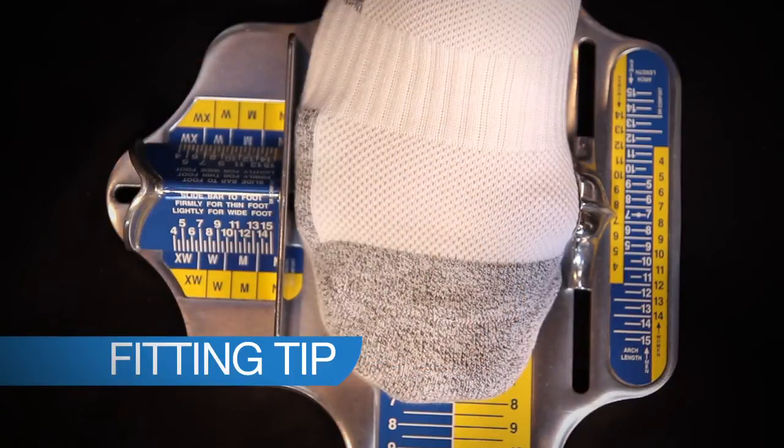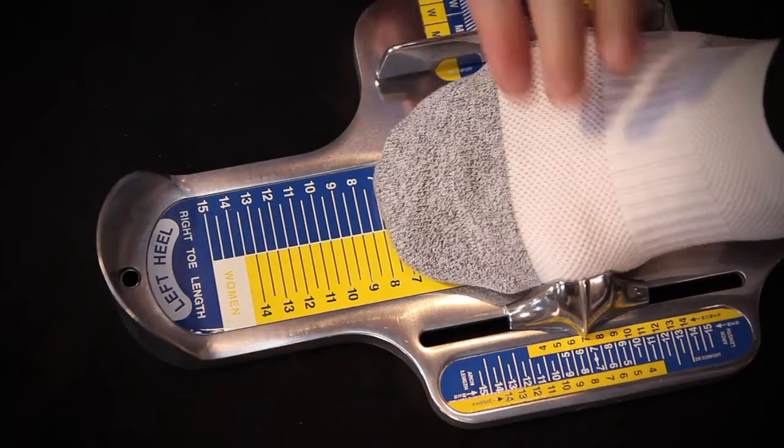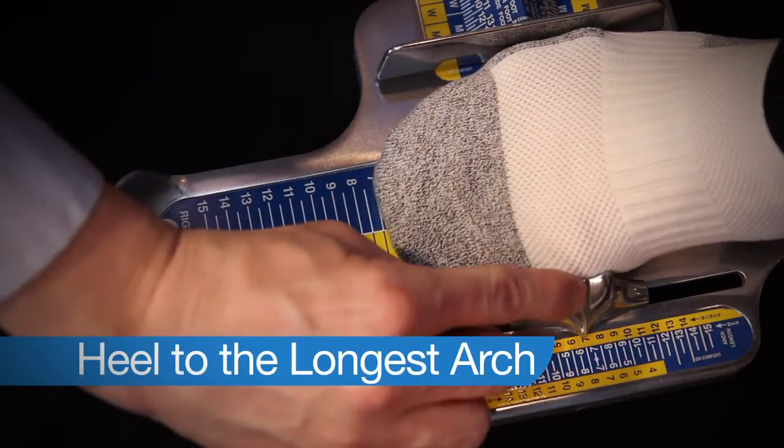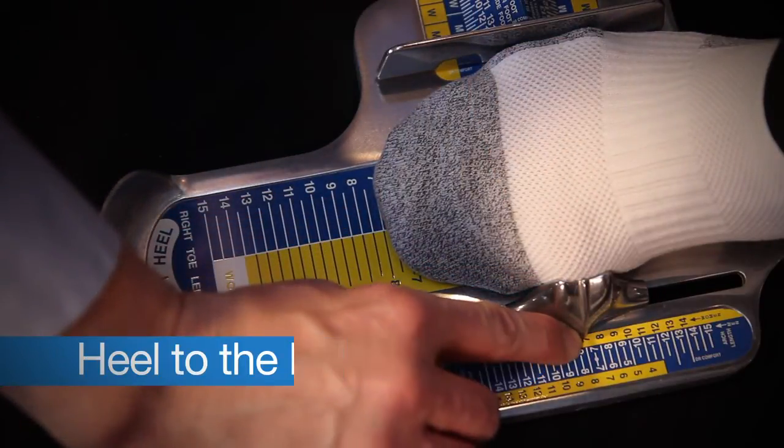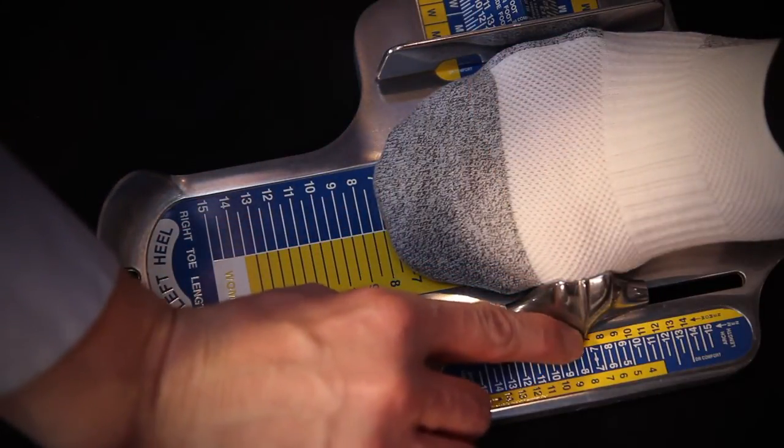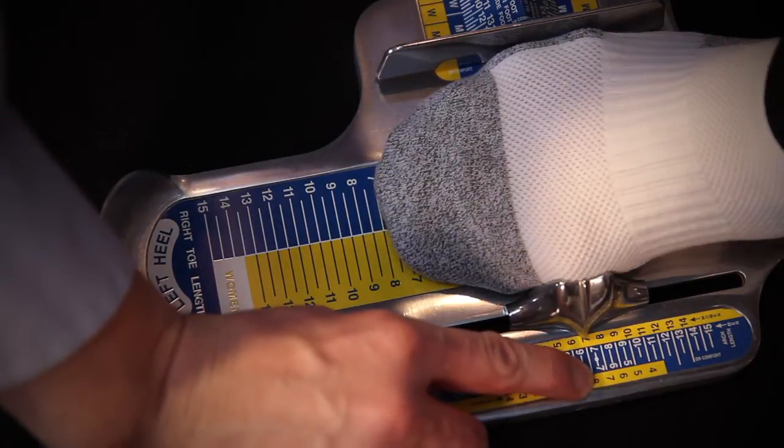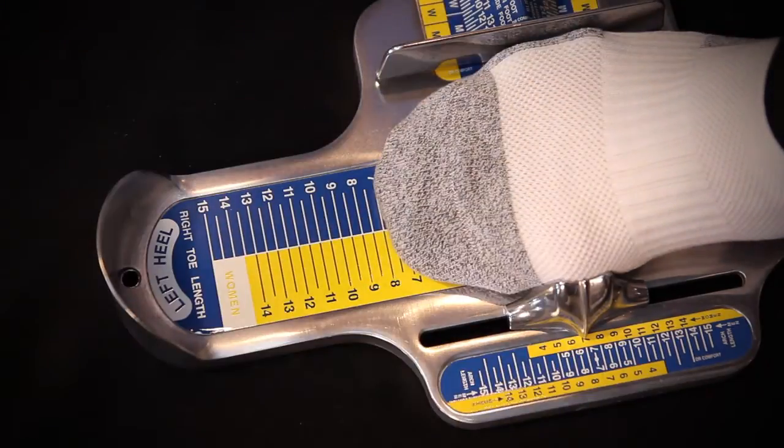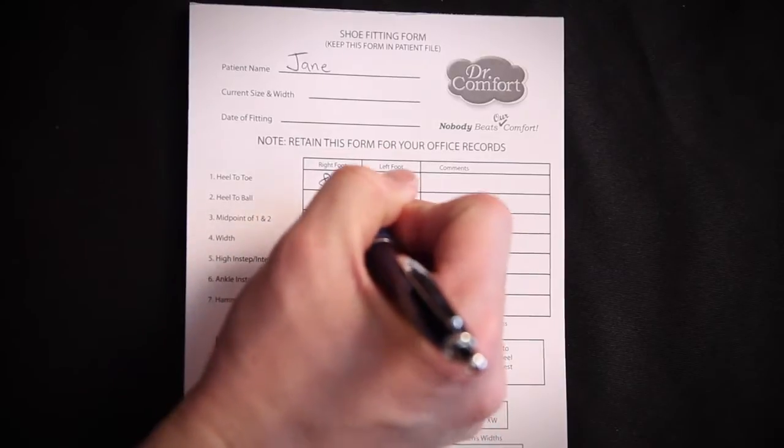Here's a fitting tip for this situation. If you come across a patient with their second toe longer than their first, measure to that digit. Next is the heel to the longest arch. The arch is also known as the metatarsophalangeal joint or the ball of the foot. Again, reading numbers facing me and in yellow, because Jane is a woman, I'm going to read that that indicator is a size 8.